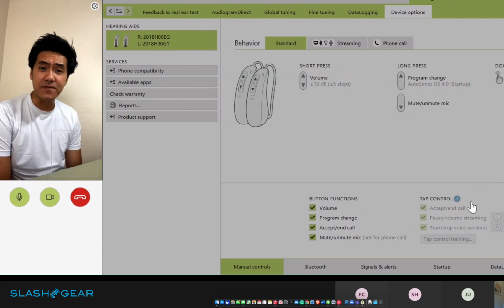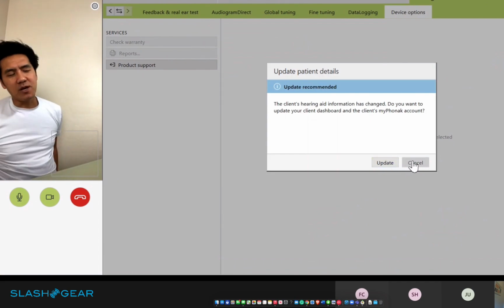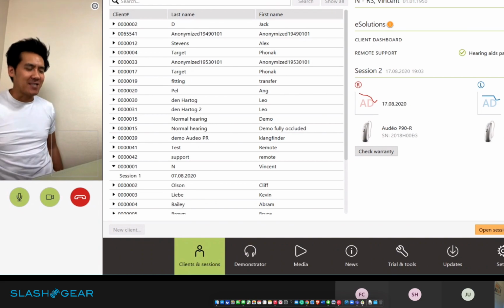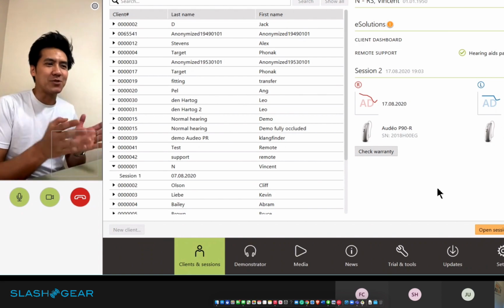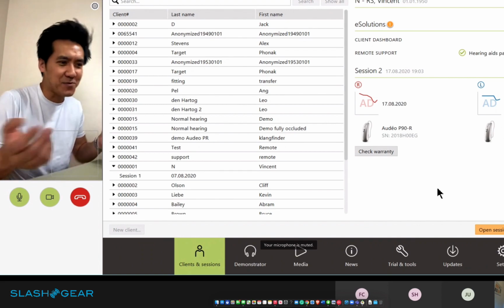Oh, I see finish on my side. By the way, I love this mute unmute mic button feature. It's really funny, but I always wished there was a physical way for me to do that, instead of fumbling through the phone. I'm happy that you showed that to me and we're able to flip that on without me even asking for it.